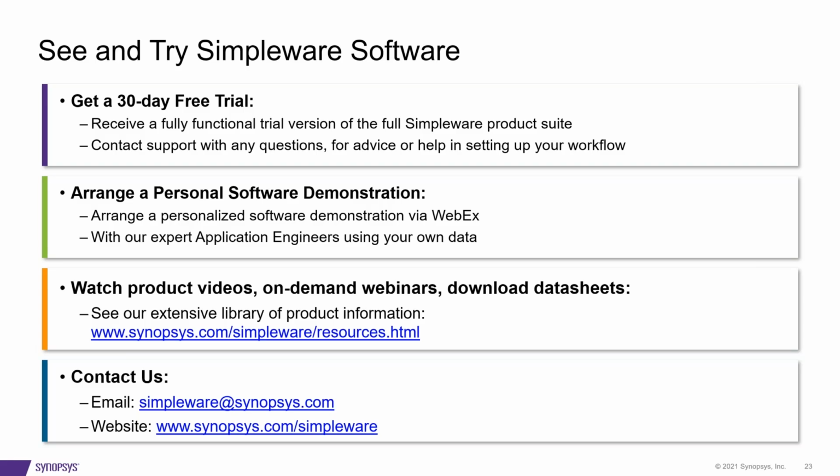Also, I should mention all of our AI tools are on the tool itself. You don't have to upload to an external cloud server. A lot of people have a lot of sensitivity with data, especially uploading patient data to the cloud, which is a big no-no in certain areas. So this is all performed locally, so that's not an issue. And it runs on standard laptops as well. That's the other thing. You don't need a huge workstation to run it.